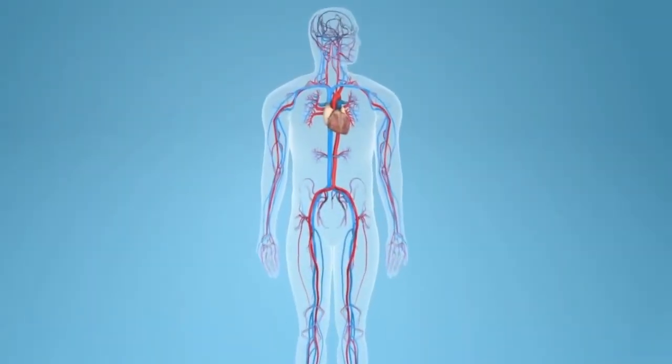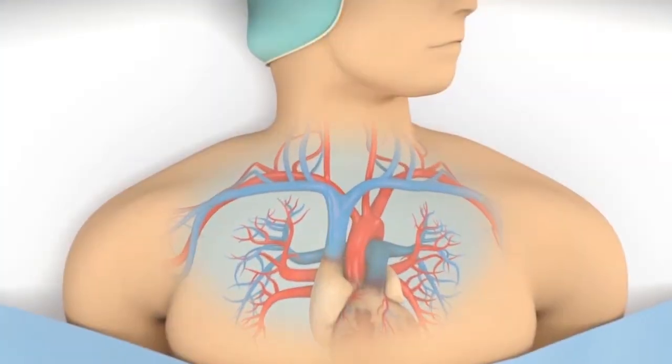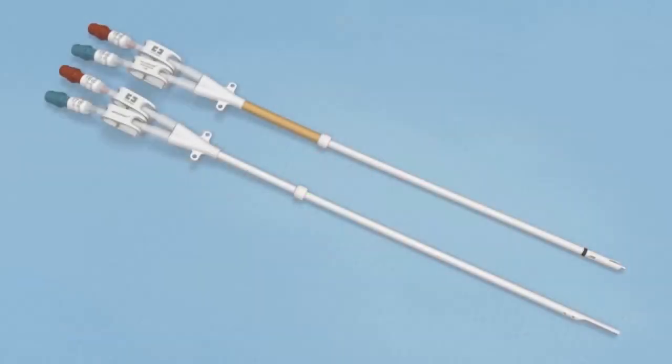The Palindrome Precision Chronic Catheter and the MAHURKAR Chronic Carbothane Catheter are ideally placed in the right atrium via the right internal jugular vein. If placement through the right internal jugular vein is not viable, the catheters can also be placed in the external jugular, subclavian, femoral, or saphenous veins as last resorts. The right internal jugular vein is recommended by the Kidney Disease Outcome Quality Initiative guidelines if it is available as an insertion site.